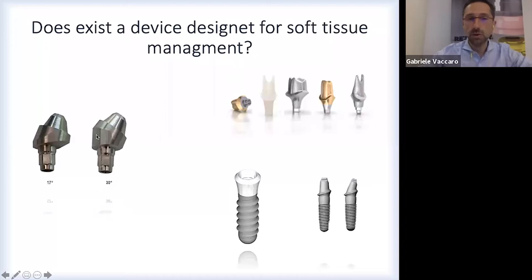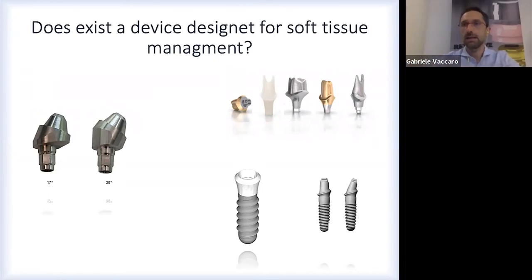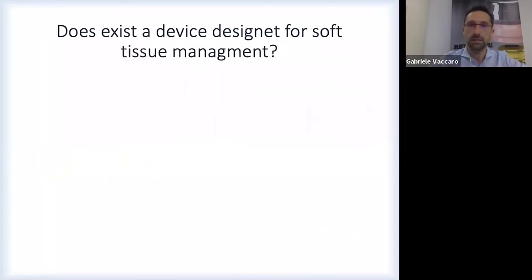A smart solution is the multi-unit abutment because it can compensate for the implant disparallelism, but it has some problems. It has an empty space inside, and this becomes a chamber for bacteria and other debris that grow inside. And we have a fixed height also in this, 4 millimeters here and 2 millimeters here. And as we saw in the previous slide, it can be a very awful outcome from an aesthetical point of view.